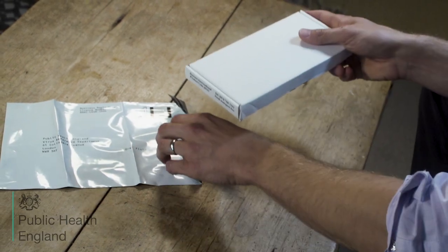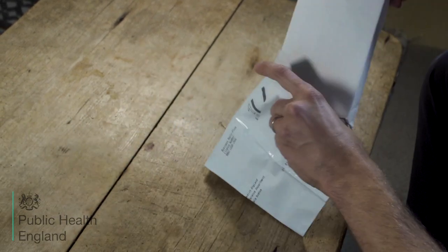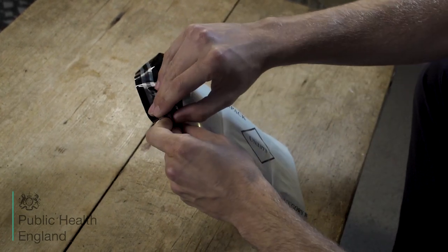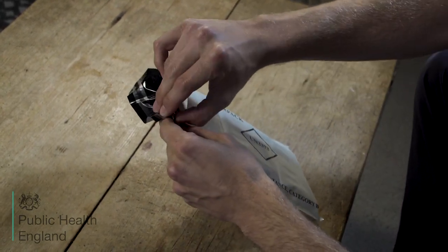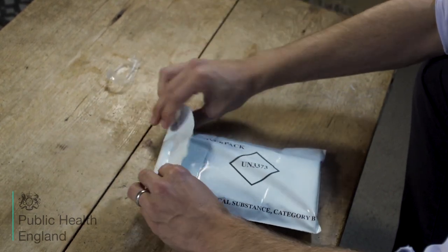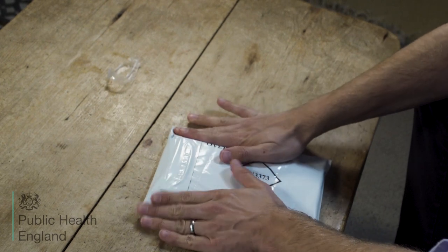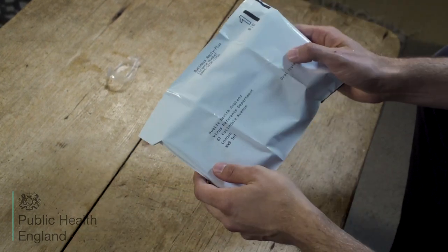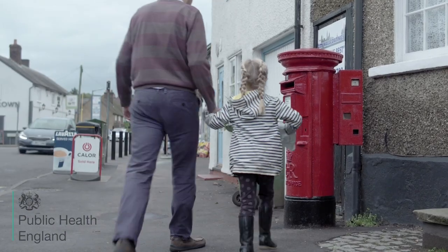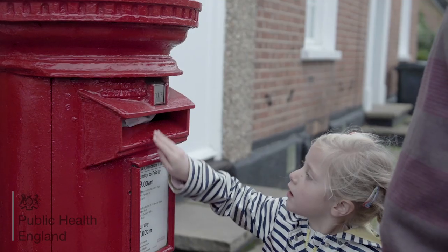Then place the box in the grey plastic bag F and seal. Post the grey plastic bag as soon as you can into a Royal Mail post box as shown. A stamp is not required.